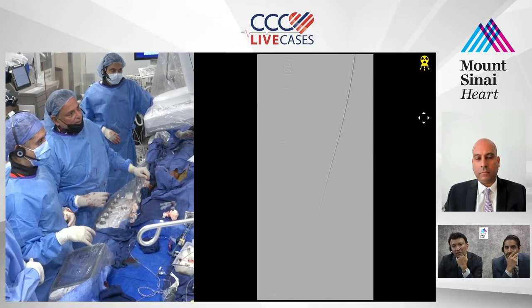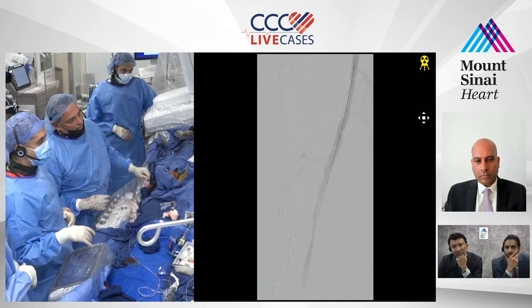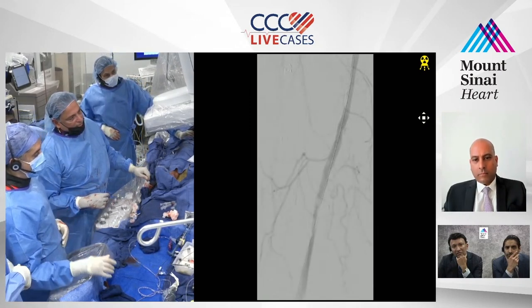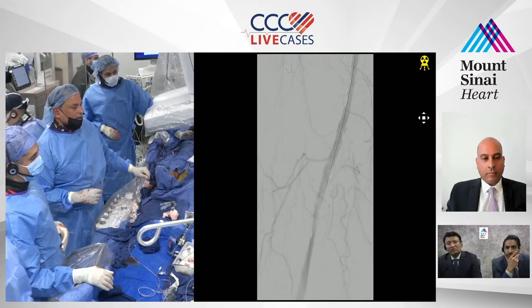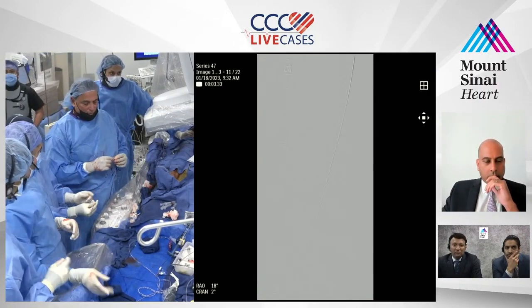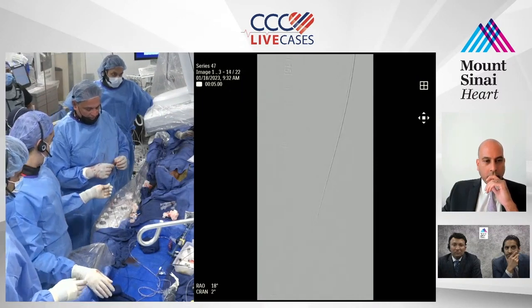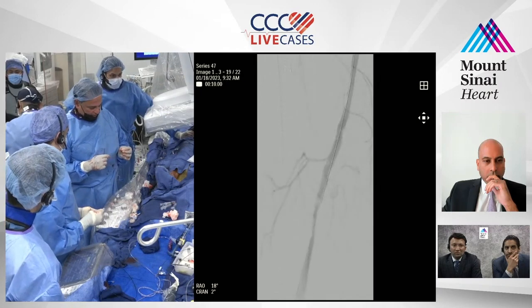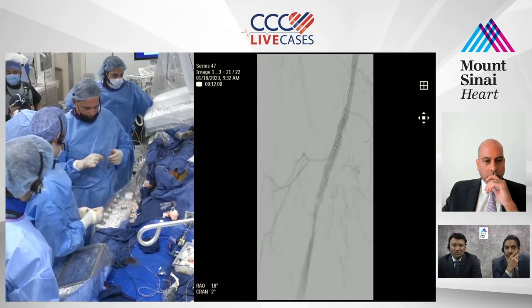My question was about rupture right at that popliteal area. I think we're okay. Look at the amount of recoil. Obviously a lot of recoil, so we're going to have to really balloon this open. What I may do now is put a 035 wire up and take a 035 balloon. We're going to have to cut it here. It's trashed. You don't have to cut it all the way here.